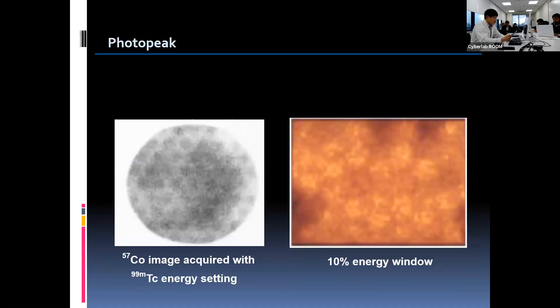These images show the error that occurs when we use the wrong energy setting. The image on the left is obtained when we acquired the cobalt source with the technetium energy setting — PM tubes are visualized, which is undesirable. The error in the right image happens if we use too narrow an energy window. The shape of the PM tubes is also visualized, and there is some decreased intensity on the upper margin and on both sides.